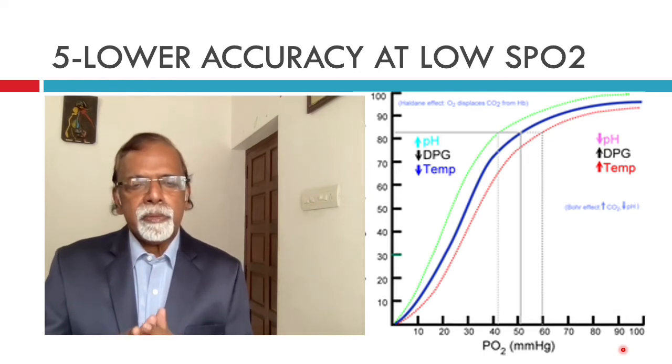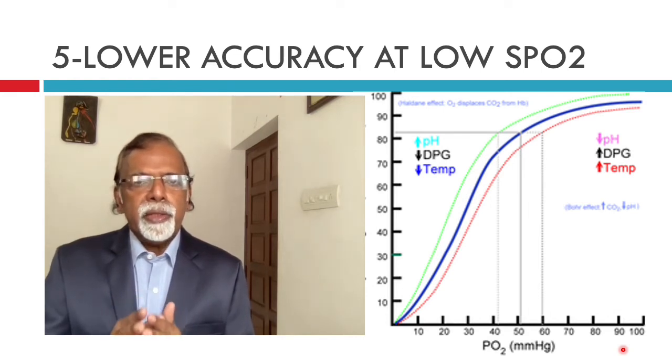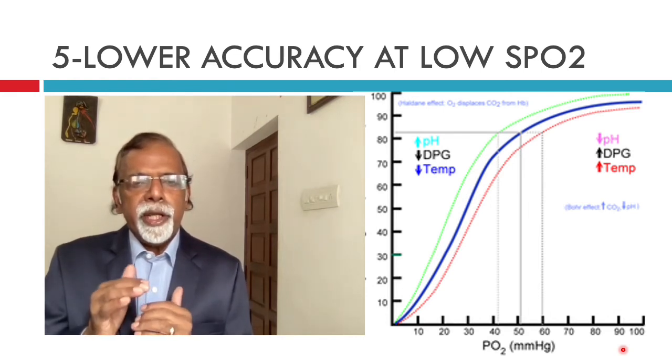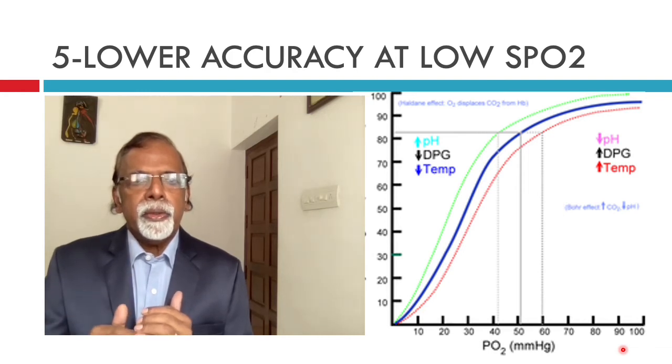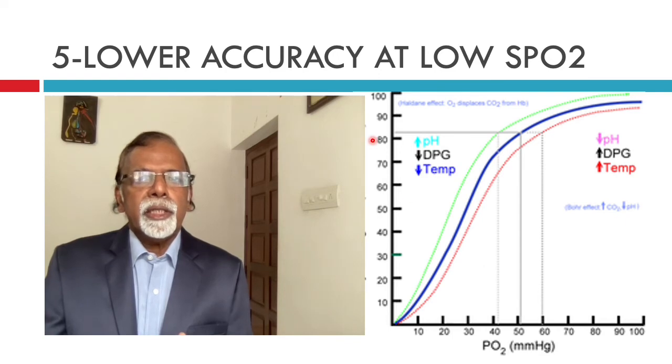That is, SpO2 is not a sensitive method to determine PaO2. Only once there is a significant drop in PaO2 do you get a lower SpO2. This should be kept in mind.